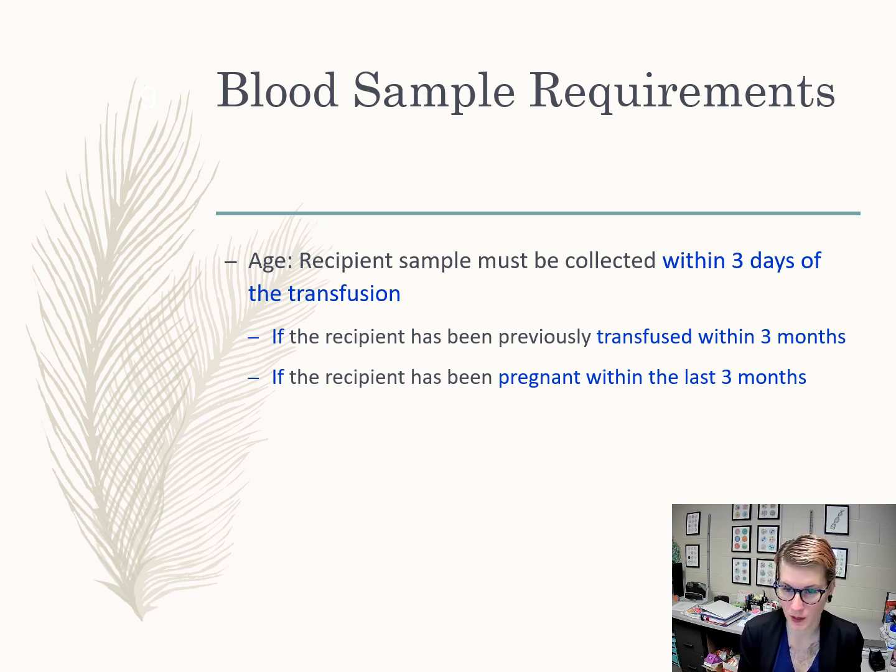If the recipient has been transfused in the last 3 months, they might be developing antibodies, or if the recipient has been pregnant within the last 3 months, they might be developing antibodies as well. There are some situations in hospitals where they might extend that date for surgeries, future surgeries, so that they have time to find compatible blood if needed.